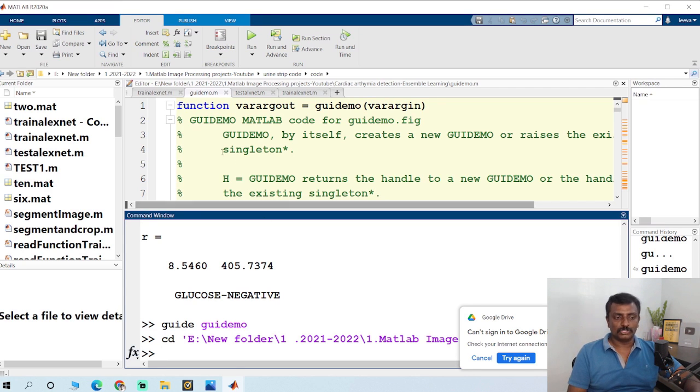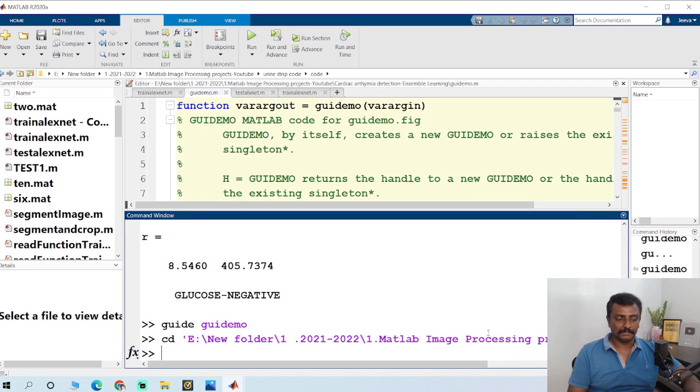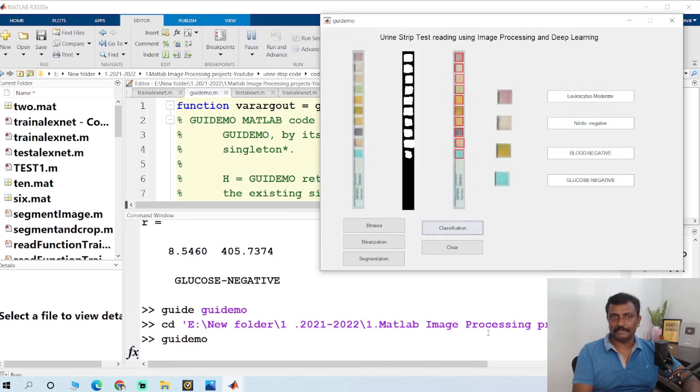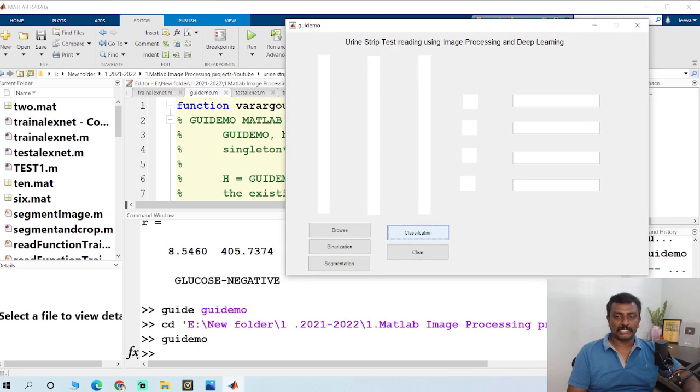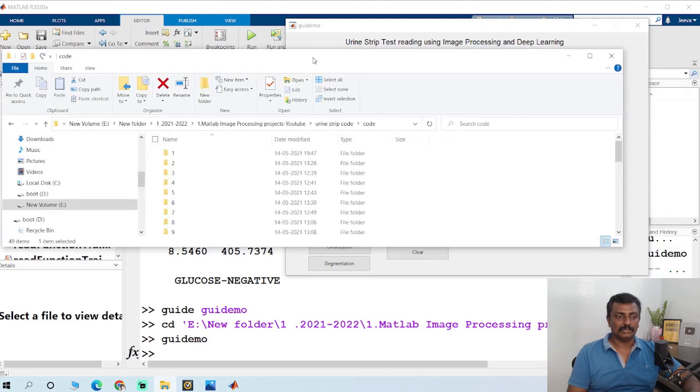Once you change the path, you have to run the main file. GUI demo is the main file. In this project, we have different images.